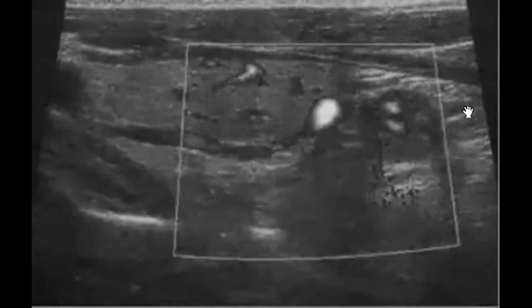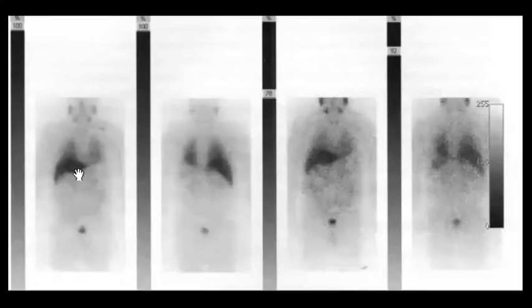And again, because I see a question from Ivan. Okay. The pheochromocytoma in the MIBG, if it takes uptake, it is pheochromocytoma. If it doesn't take uptake, like in this case, there is no uptake in the right adrenal, this means it is undifferentiated. When it is undifferentiated, it will be carcinoma.